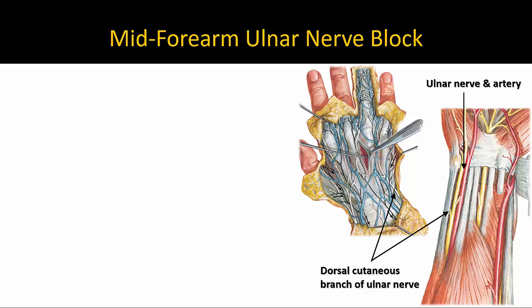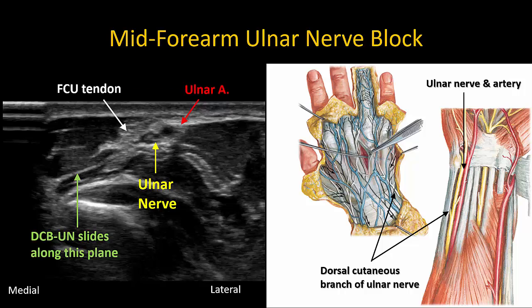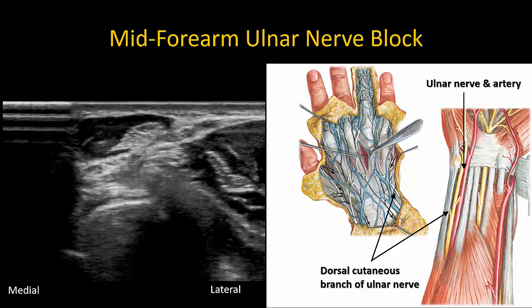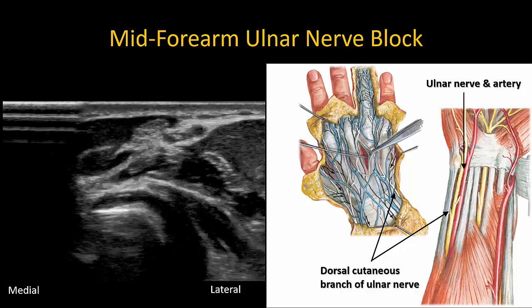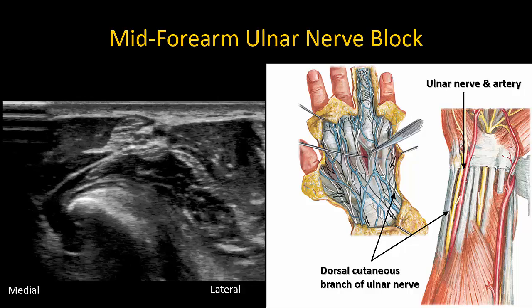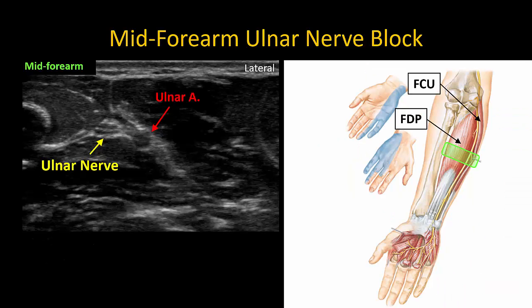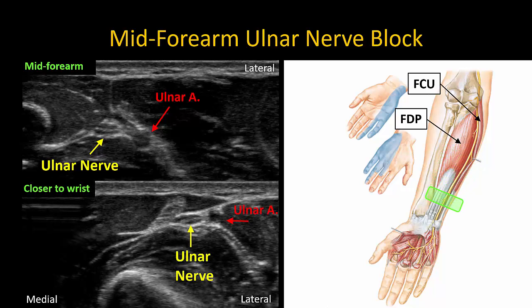The dorsal cutaneous branch runs under flexor carpi ulnaris tendon and winds around the bony ulna to innervate the dorsum of the medial hand and the fourth and fifth digits. On this dynamic back-and-forth ultrasound scan, the dorsal branch can be seen separating from the ulnar nerve on ultrasound close to the proximal wrist crease. A more distal injection site may be chosen if complete motor sparing of flexor carpi ulnaris and digitorum profundus is desired.